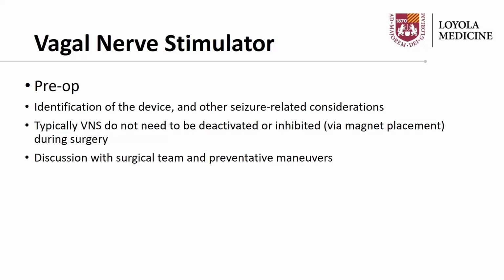However, a discussion with the surgical team is needed to minimize damage to the electrical circuitry from the electrocautery and positioning of grounding pads, very similar to other device recommendations, so as to prevent current flow through the device system and keep the current as far away from the device generator as possible.